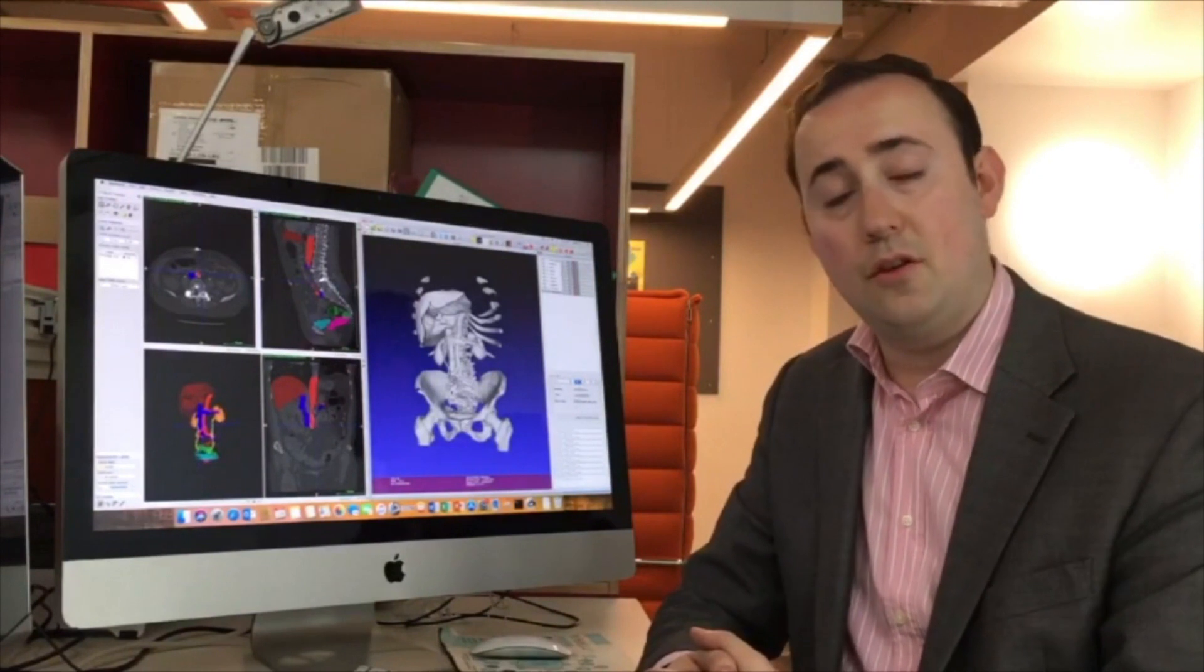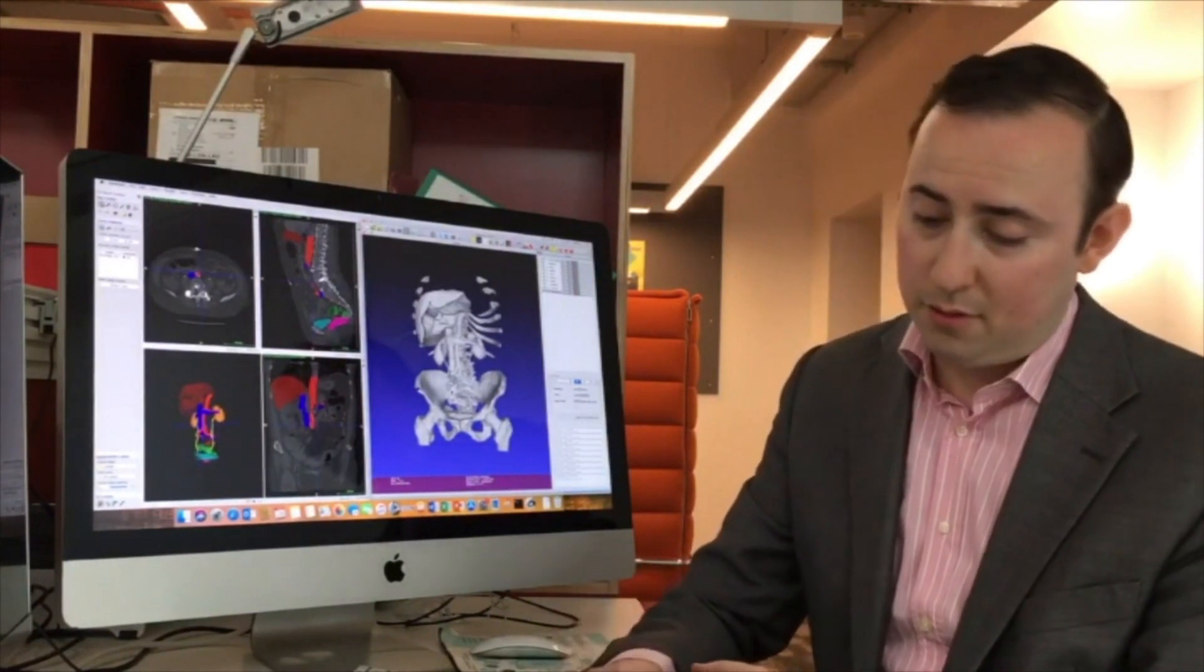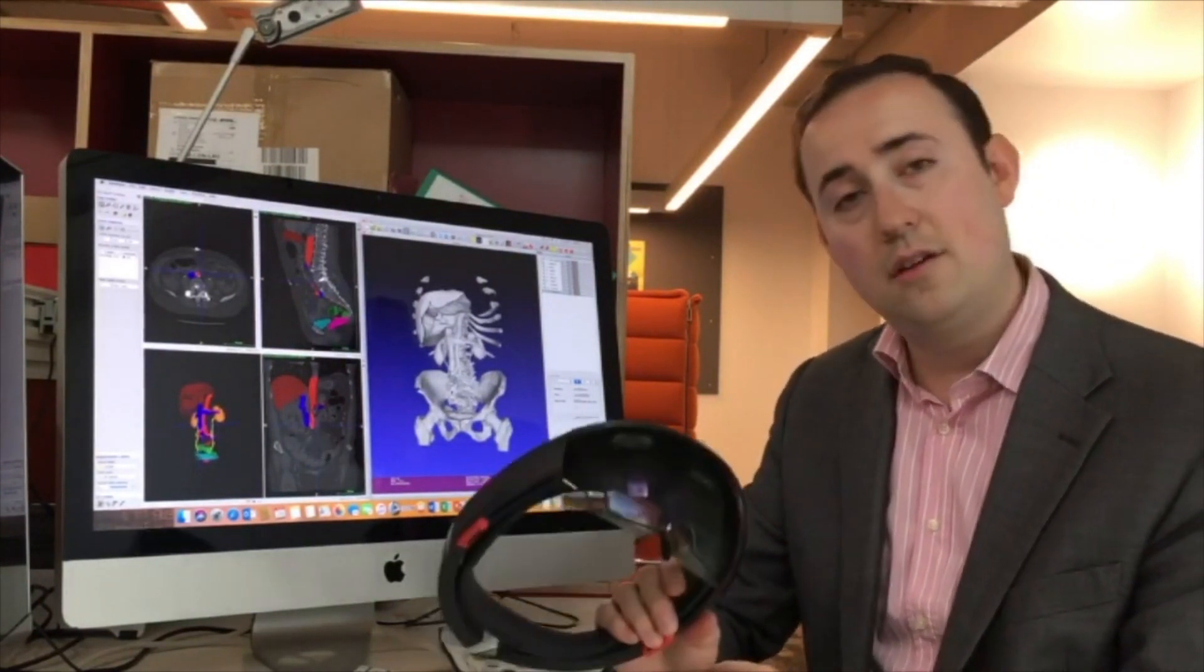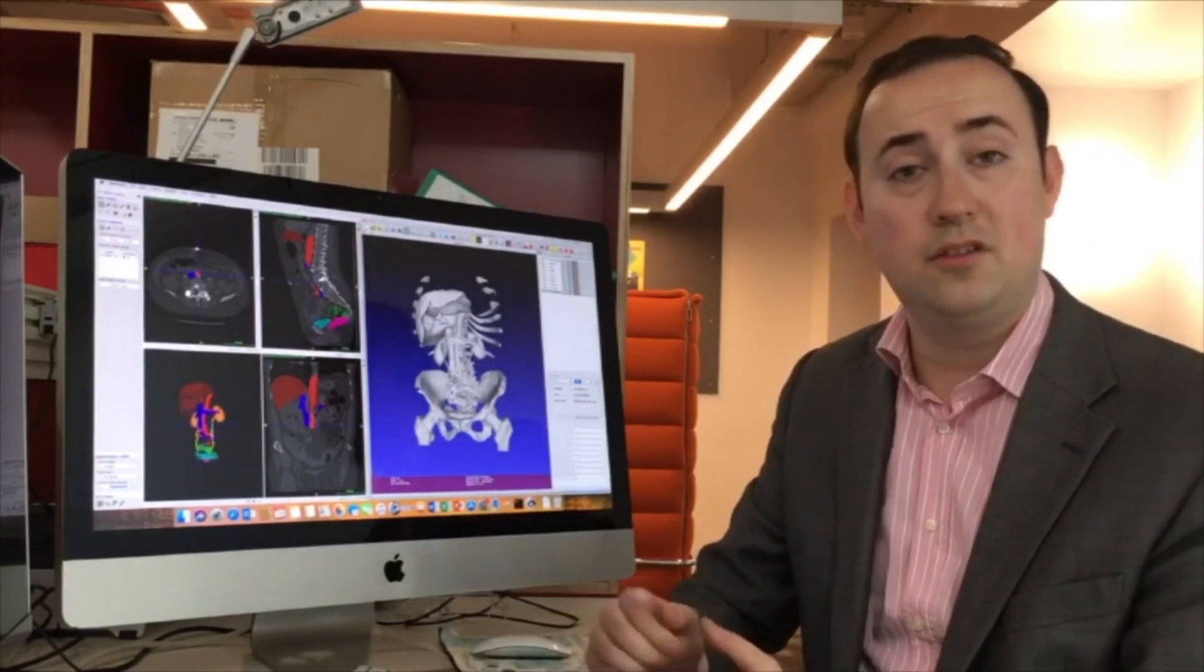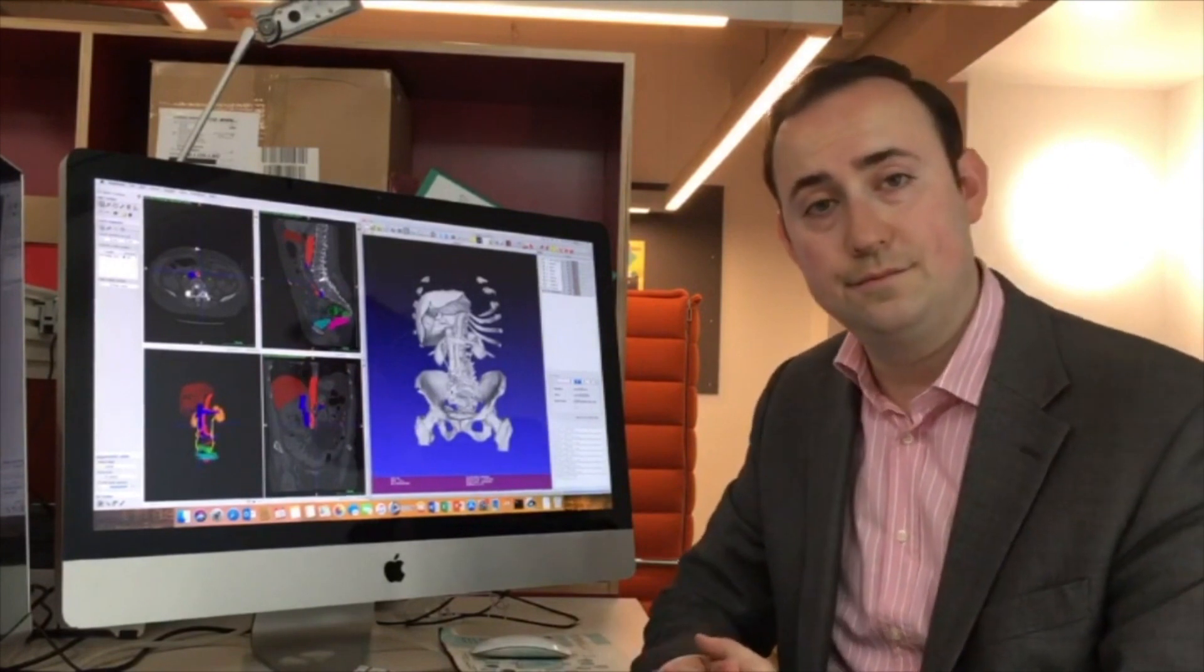This can then be loaded onto multiple viewing devices. We use the Microsoft HoloLens that can be used in theatre and controlled in a sterile manner.